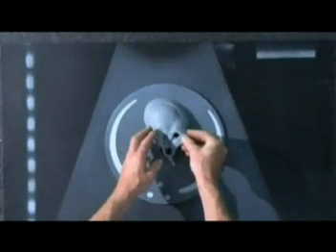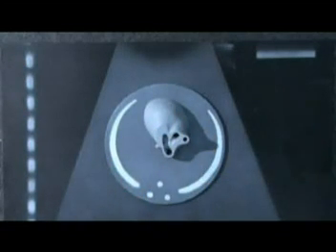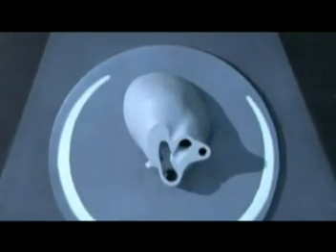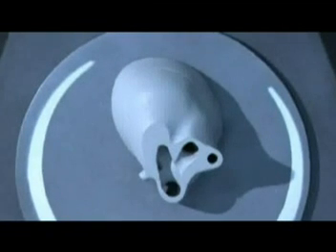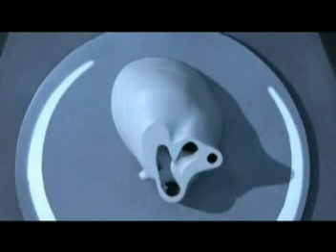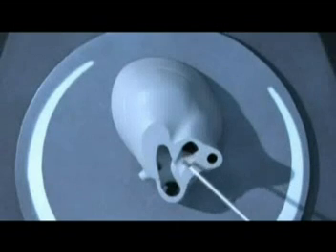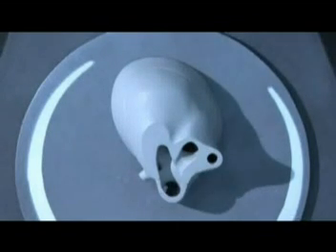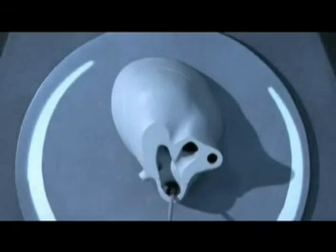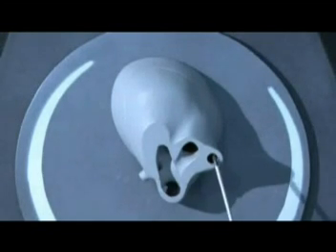Moving a fraction up towards the baby's head, you then start to see the aortic arch. In the previous section we saw the ductal arch run straight back into the descending aorta. Moving fractionally up, you still see the ductal arch, but as you come above the point where the right branch branches off, you then start to see the aortic arch come over the top of the right branch and head to exactly the same place that the ductal arch is — heading down into the descending aorta. Alongside the aortic arch, which is now on the right side of the baby, you see the superior vena cava.